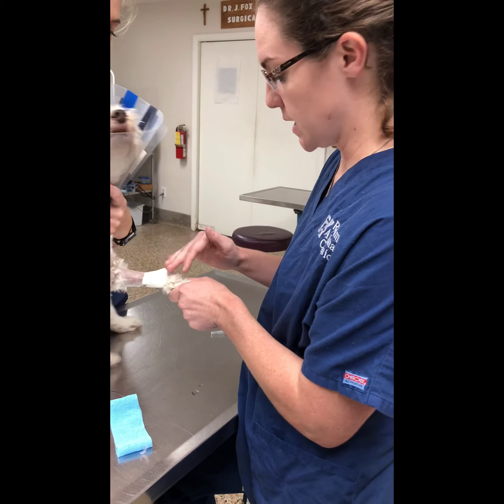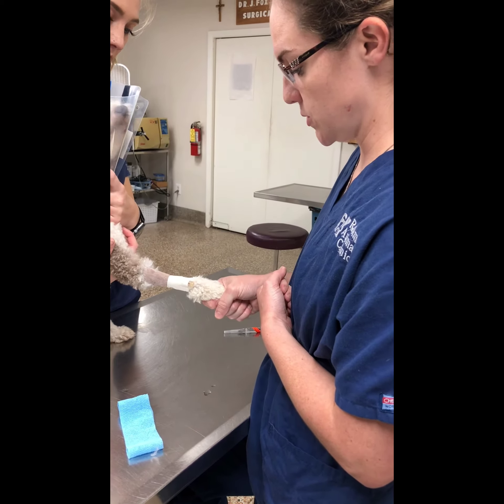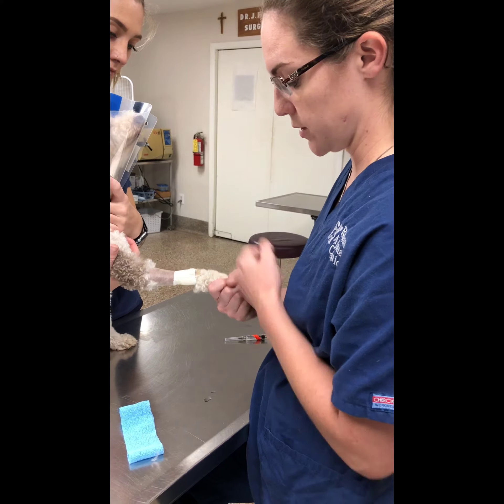Everything looks good — it's not soiled or wet, it's flowing well, and it doesn't seem that it's too tight. So I think we're good on this one for right now.